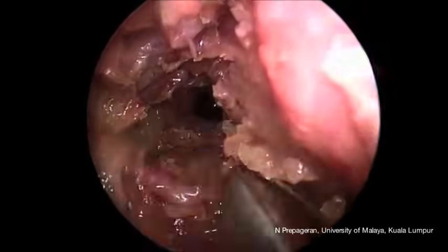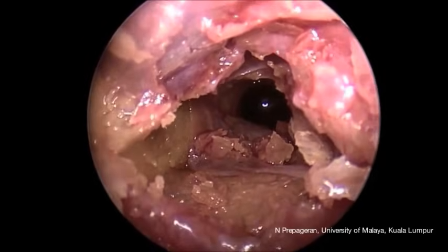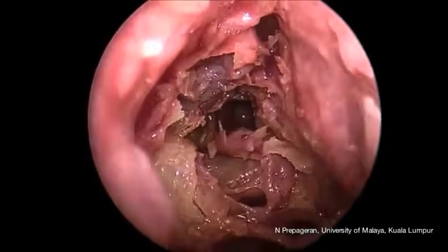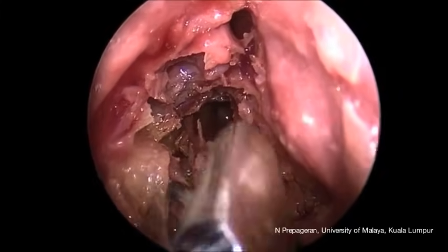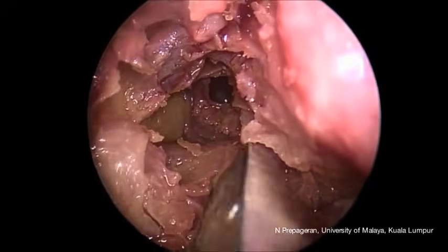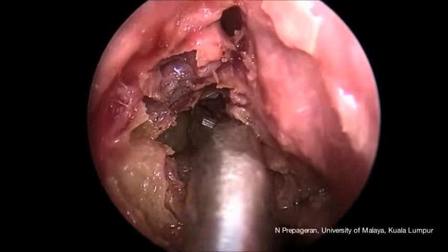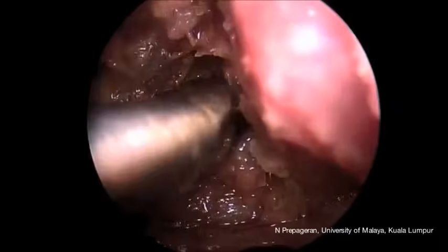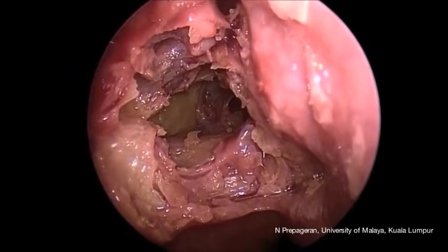That is the mucosa of the posterior ethmoids that we are stripping — which in real life we would not do, but we do it here for cadaveric dissection. Subsequently, let us clear up a bit more to appreciate the anatomy. We are using forceps to remove the mucosa of the posterior ethmoids so we can appreciate how lateral to the posterior ethmoids is the lamina papyracea, and medial to the posterior ethmoids is actually the superior turbinate, which forms a landmark confirming we are in the posterior ethmoids.